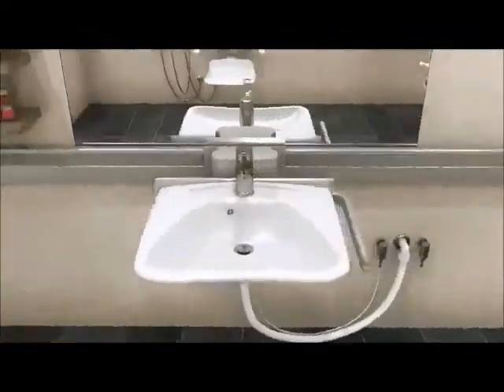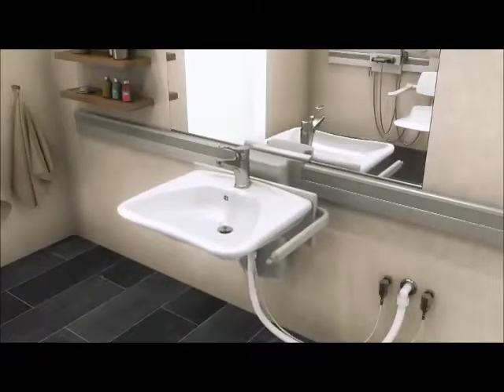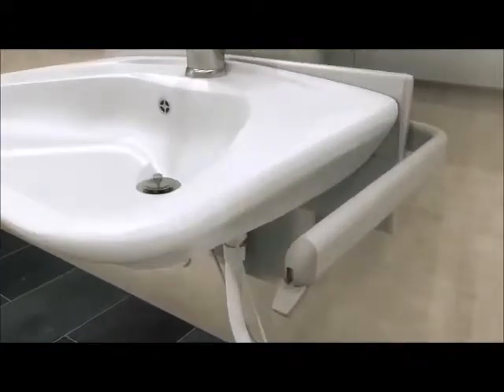The wash basin from the Presolite Care Plus series can be moved sideways on the horizontal rail and adjusted in height. This gives both standing and seated users multiple options.